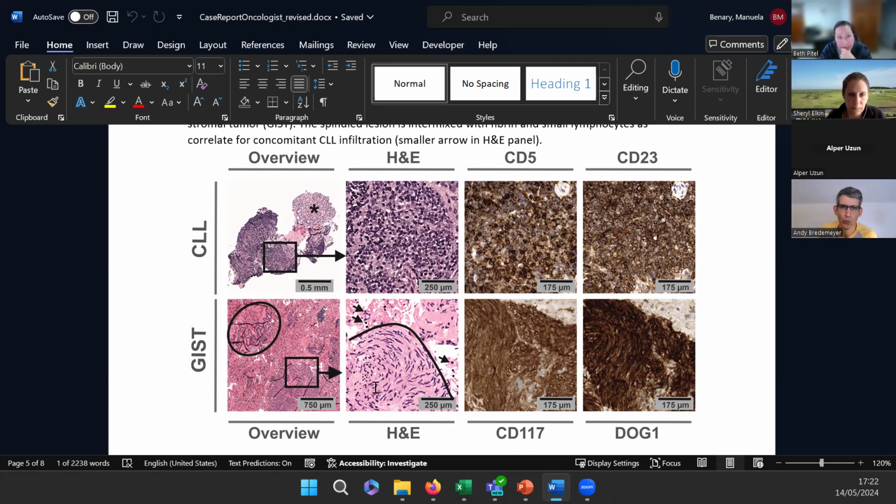And based on the H&E staining, I wouldn't say that the infiltration is that large, if I assume that the dark spots are the infiltration. Yeah, the infiltrating leukocytes are actually annotated by the arrows in the H&E. So you see the round nuclei there. Those are your infiltrates.